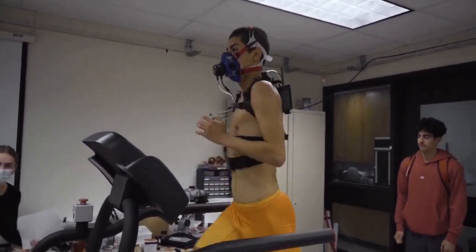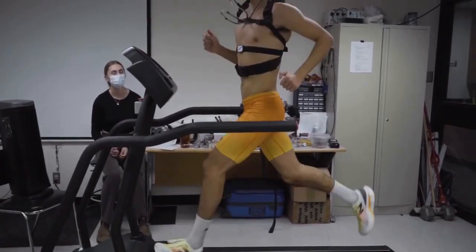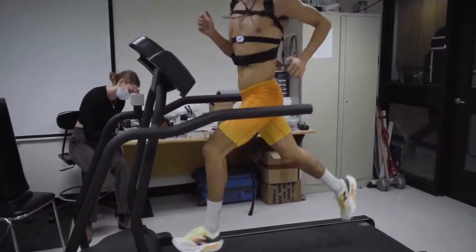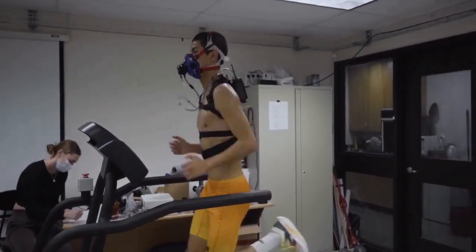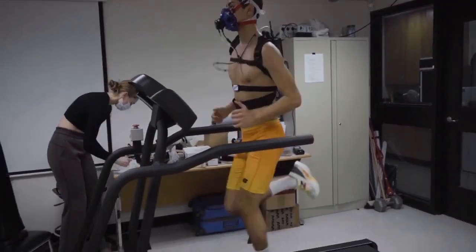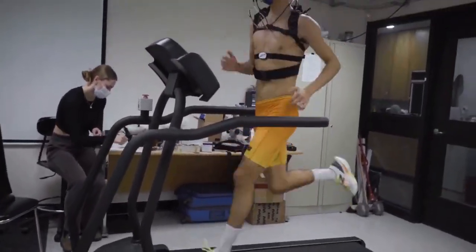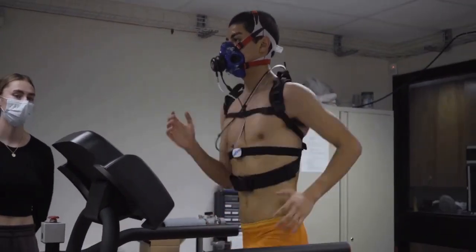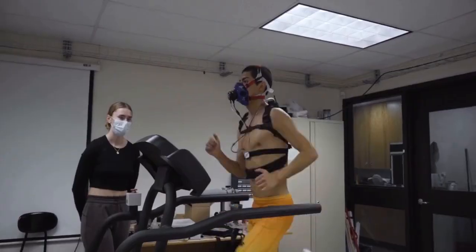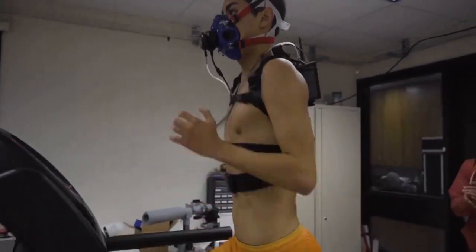Keep your form. 30 seconds left. We're at one each — heart rate 184. You're not even working. We're going up to 3% incline next — maxed out at speed. 15%, going up another incline. 10 seconds. We're going up to 1% incline in five seconds. Come on Jose, three seconds left. Let's go.